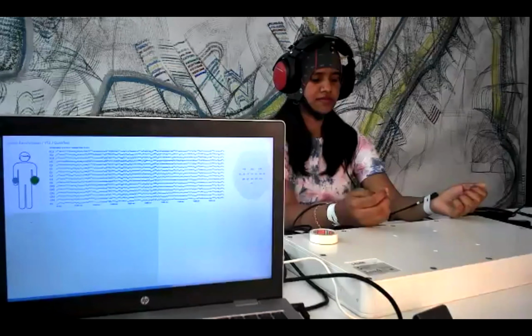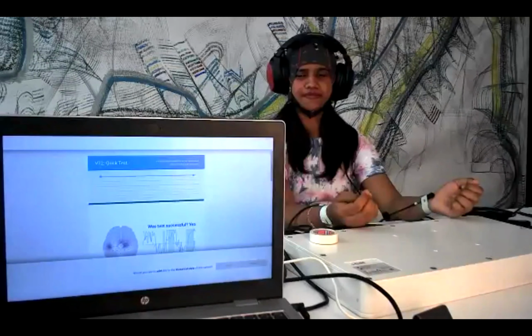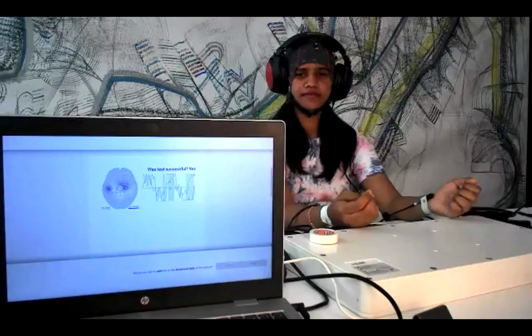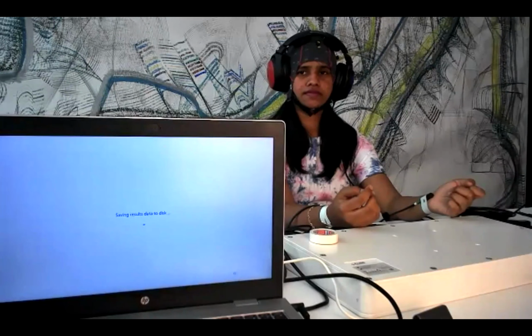Great. So this time we succeeded. Perfect. So you can see again the results here. This ERP plot is again great with a very large amplitude and a great area of significance. And it was tested successfully, which means in real time, this short period of ERPs matches very well with assessment data. Great. So again, I will save it and I will add it to the history data.